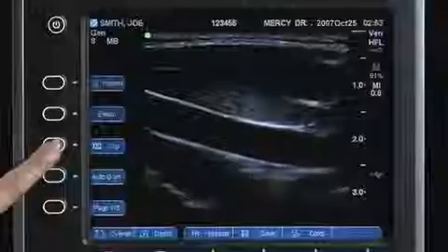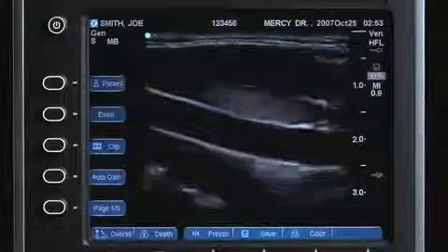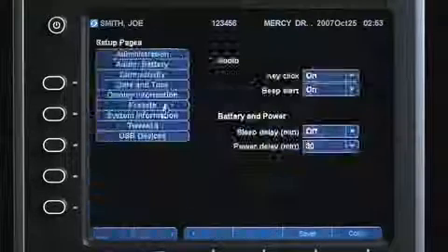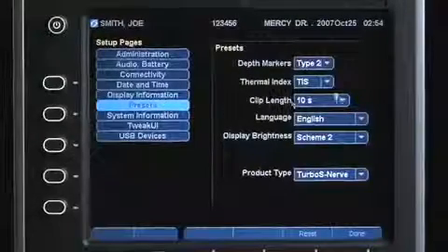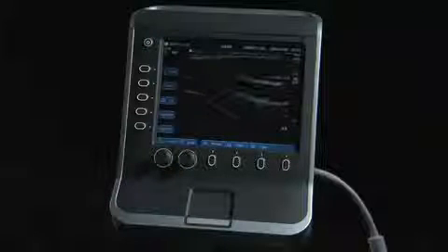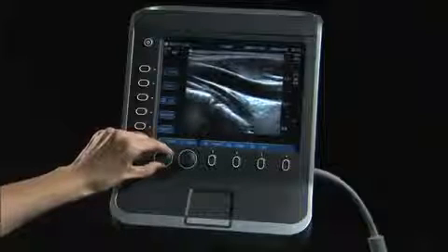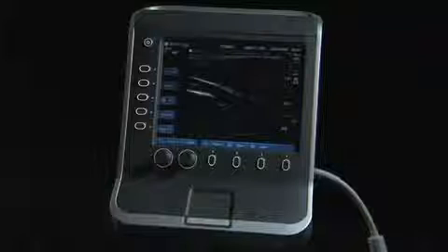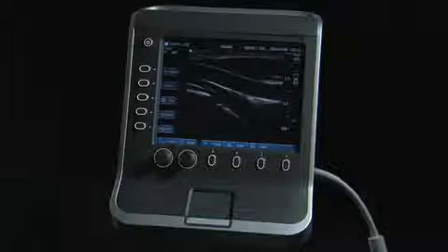The clip key allows you to save a movie of the ultrasound image. A clip length from 2 to 60 seconds may be captured. The clip length to be saved is determined in the System Setup menu. The SonoSite S-Series system can automatically adjust the 2D gain levels to the optimal level. Select Auto Gain to activate this feature instead of using the manual gain controls.